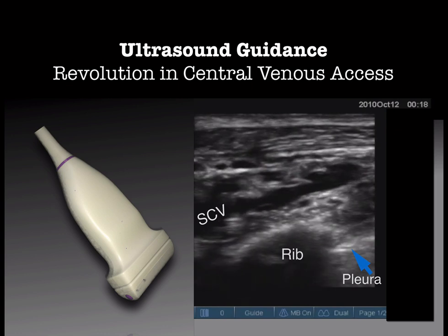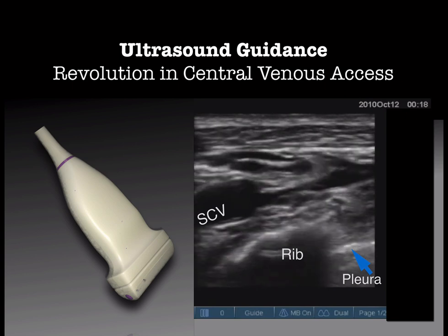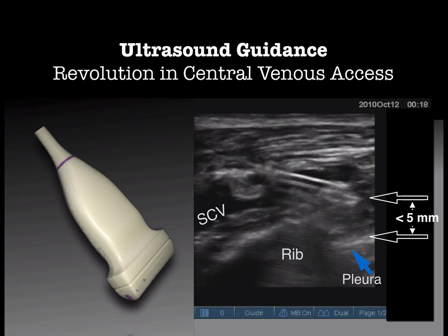Here's a subclavian vein, and we can see the needle. We can see how close we are to the pleura, where we would give the person a pneumothorax if our needle went too far. And here it goes through the back wall, but yet we saw that we did not cause a pneumothorax because we could control the needle tip because we were watching it.